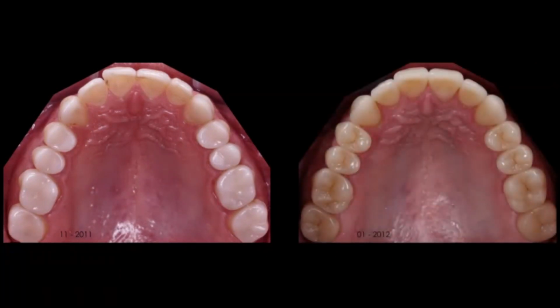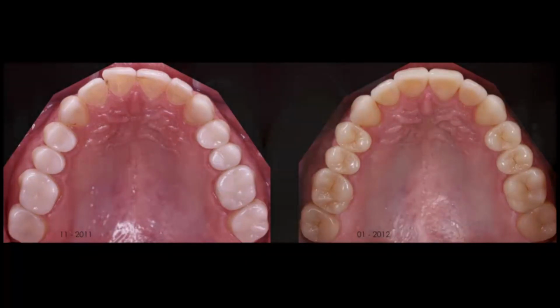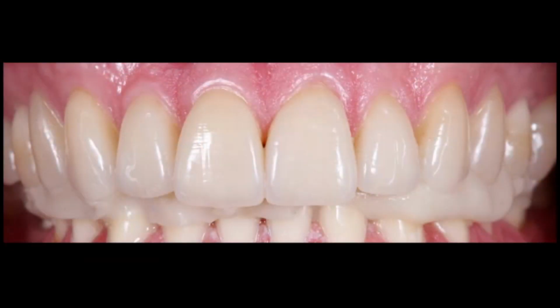This is man-made. On the left-hand side, it's machine-made. And I absolutely agree with Oliver. This level that you see on the right-hand side, you cannot reach with the machine. Impossible. Man-made, machine-made. So again, we just had a recall on this patient. This was, by the way, the beginning of 2012, after the whole treatment. This is 2.5 years later, you see him, it changed a little bit, and we are always very interested in what happened.